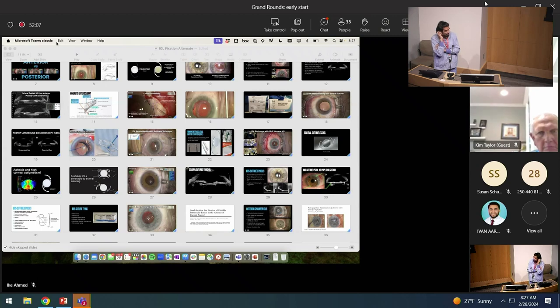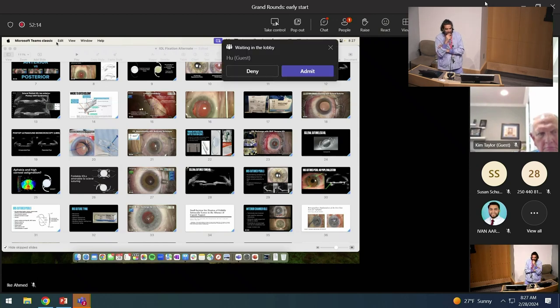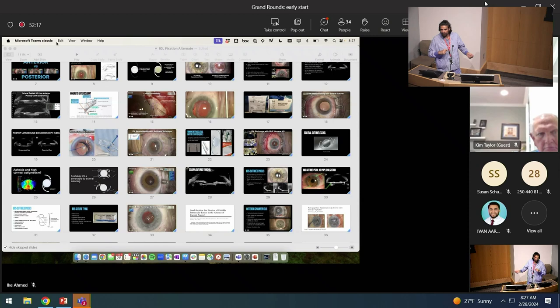We see it very uncommonly in our experience, but it's certainly a consideration. We do need better suture material. We're trying to work with Gore. Nick, I think you know that as well. To develop a good 9 or 10-0 for cornea, for iris, that's kind of what we really hope to achieve in the future.